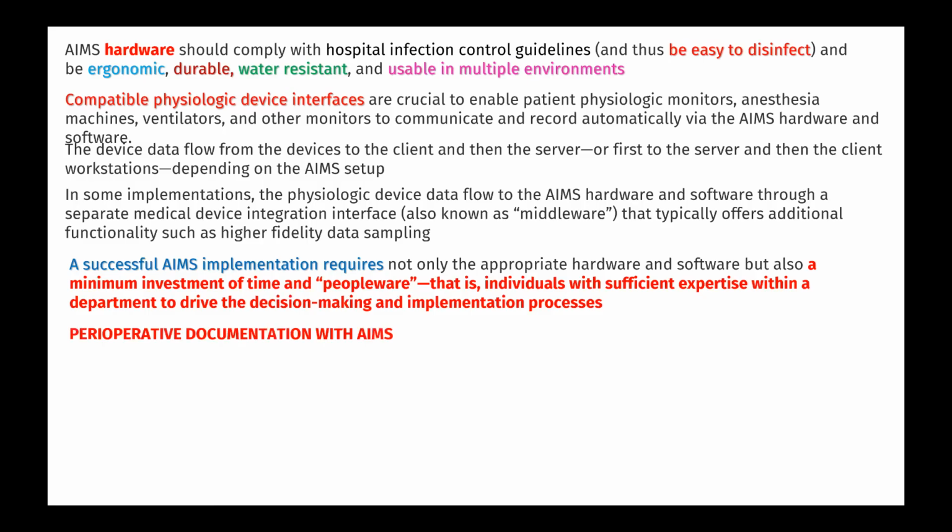They don't want to use this because, one reason I find, is that anything which is not to your liking, for example a hypertension, which you may not like to happen, will also be recorded and documented.